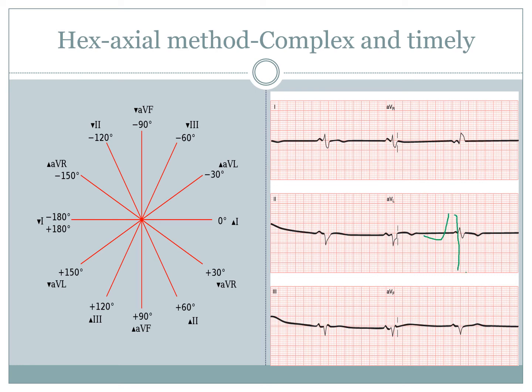So if you look at the small boxes, in the positive amplitude you'll count 4 up, and the negatives will also be 4, so therefore it's the most equal, if you will. Quite often you can just tell this by looking at it, but sometimes you need to count those leads. It's just a matter of counting the positive deflections and then subtracting the negative deflections, and the one that is 0 is the lead you look at.